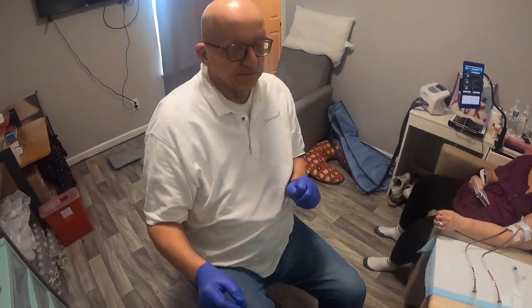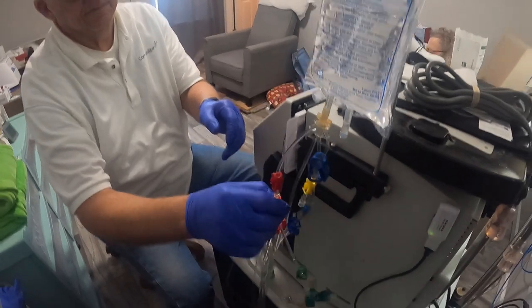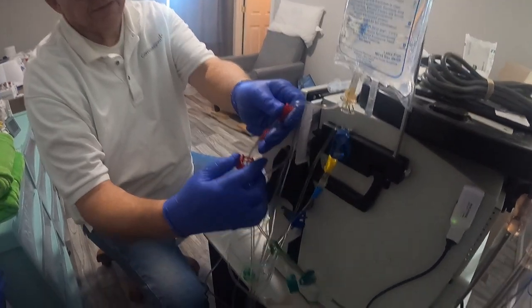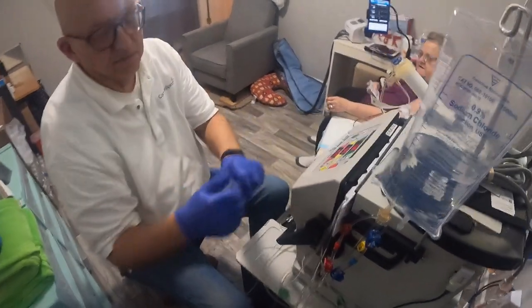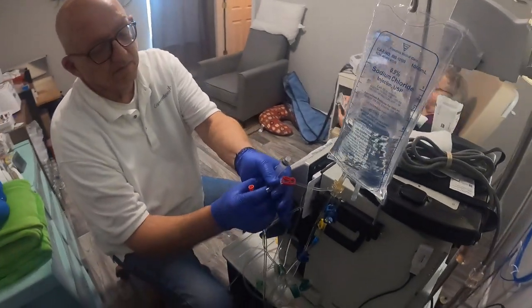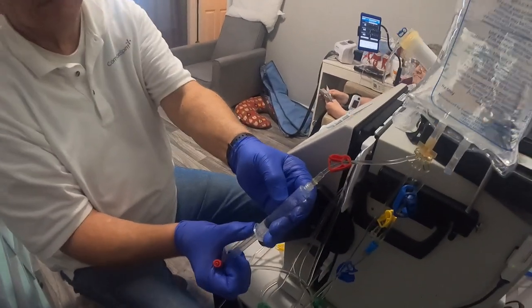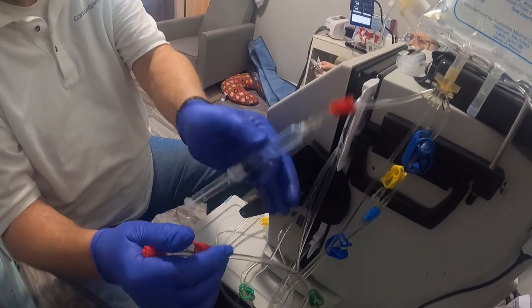Right. Yep. All right, clamp both clamps on the red line under the saline bag. And then you know, all this, it's not nearly as complicated as it looks. Yes. Disconnect and attach a clean 10 ml syringe. And what we're doing here is Trisha's giving instruction from the manual to the tech. I'm going to draw saline into that, and at the end of the treatment you'll see why we did that.